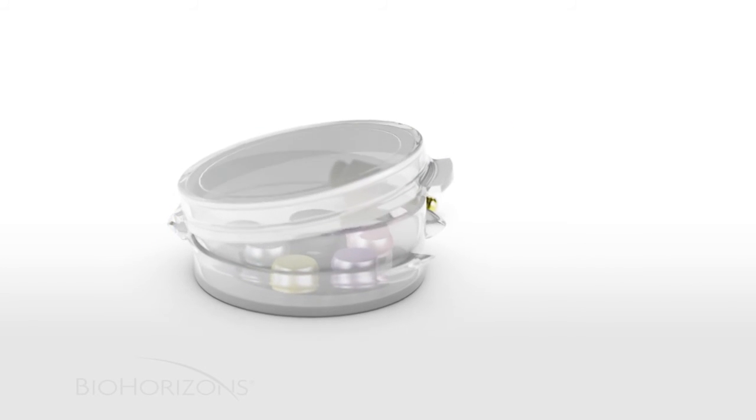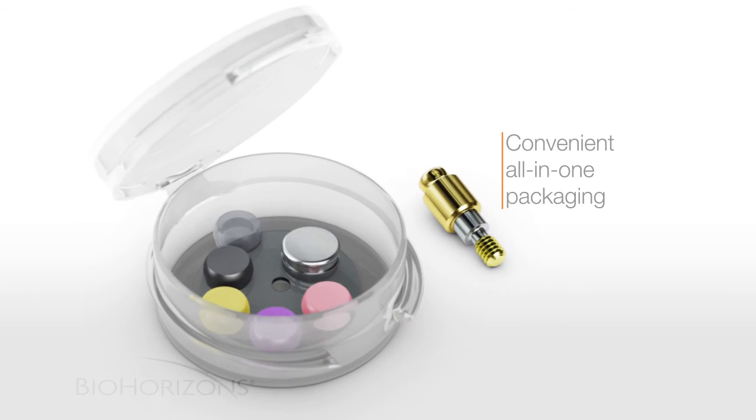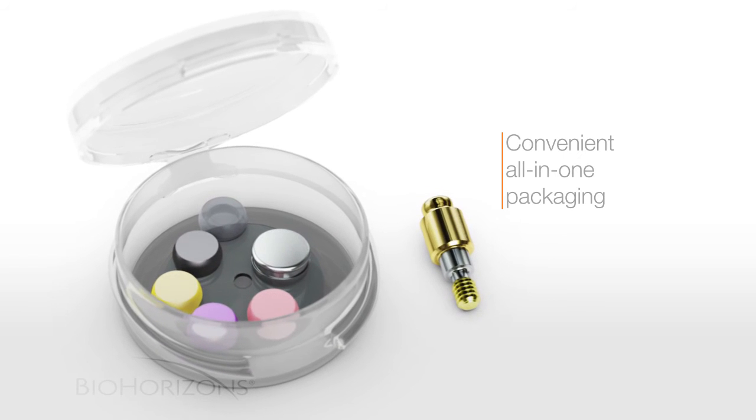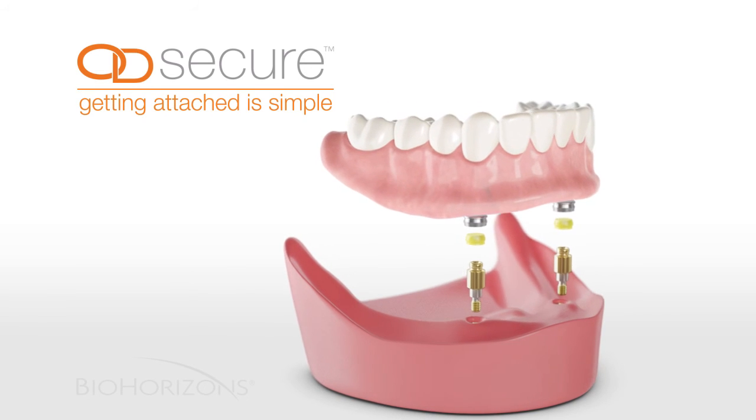The OD Secure also comes in a convenient all-in-one pack tube that includes all the parts necessary to complete your patient's denture restoration. The OD Secure abutment system — getting attached is simple.